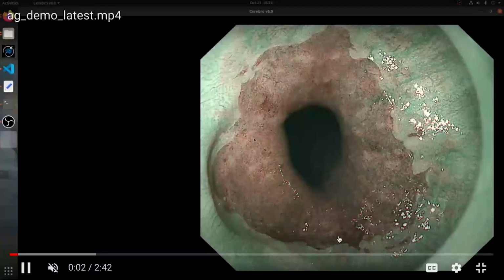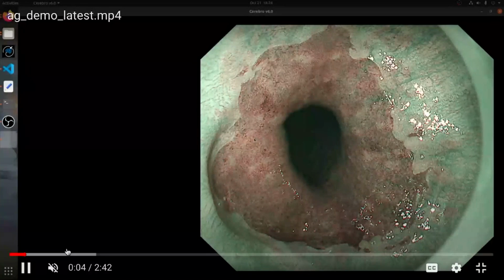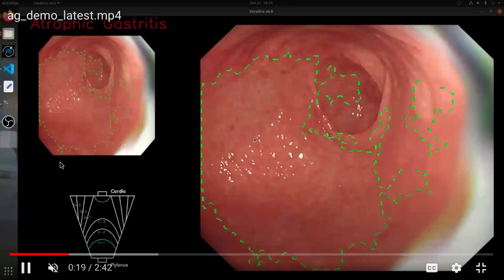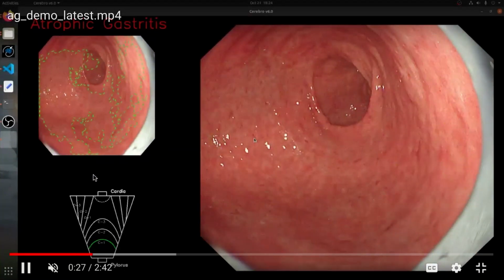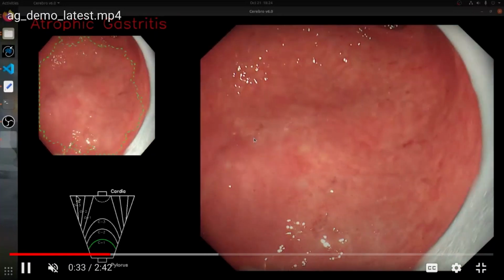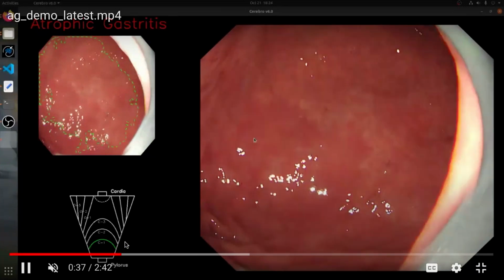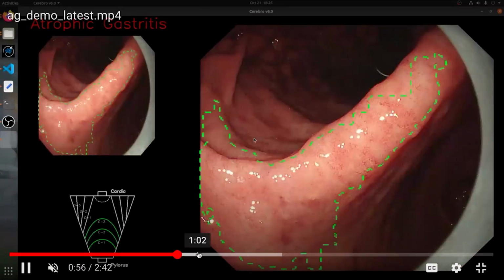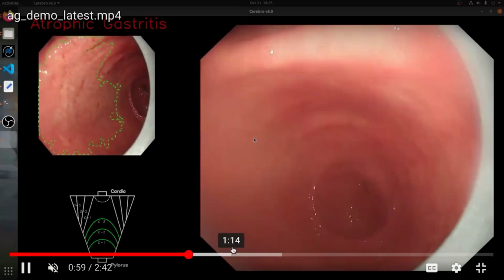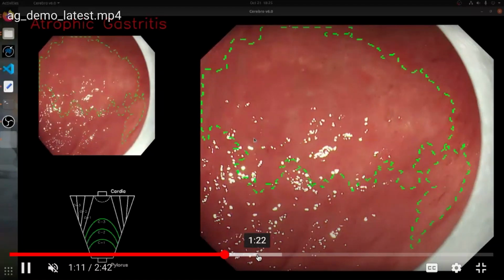So in this example, we are going to show you another application. This is atrophic gastritis. Apart from tracking the anatomical landmarks, this is another application that also tells in real time if there is atrophy inside the stomach, and it also characterizes the extent to which it has spread inside the stomach. Here we are using segmentation models as well as combining the information with the landmark tracking tool. At the bottom, you see a flattened diagram of the stomach, where right now we have observed that there is atrophy till C1. As the video progresses, we'll see that all the atrophy has been registered in this Kimura-Takemoto diagram.